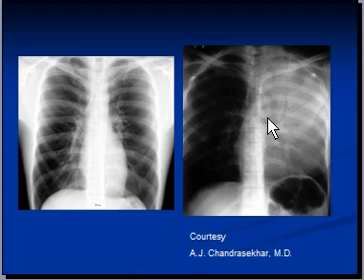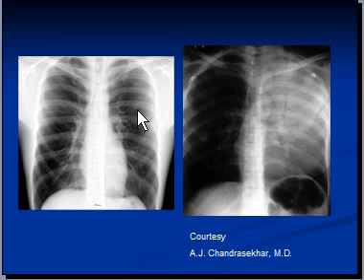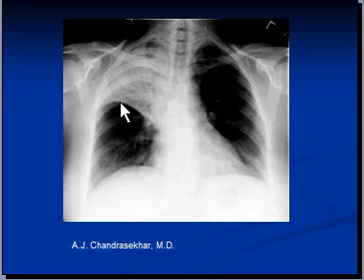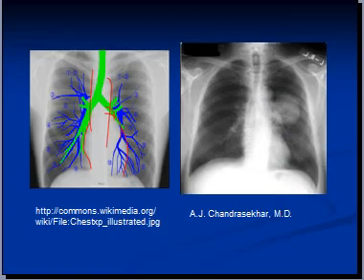These bronchial branches are clearly visible through the consolidated lung, whereas they would be impossible to see in normal lung. Air bronchogram is visible through this consolidated lung as well, and you can also see an air bronchogram in the right upper lobe in this X-ray.